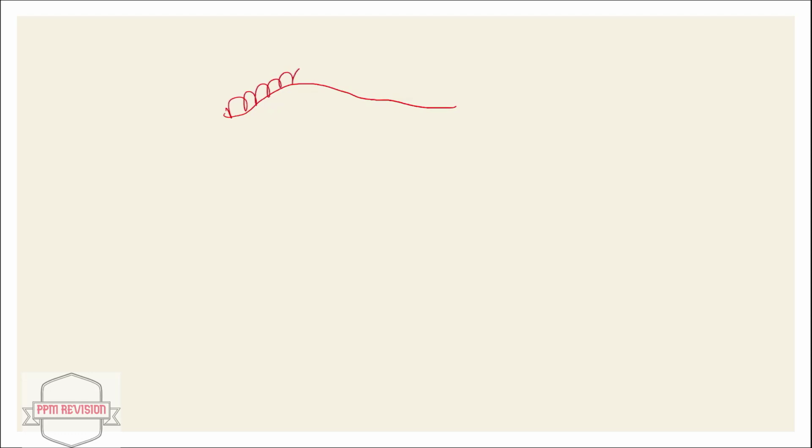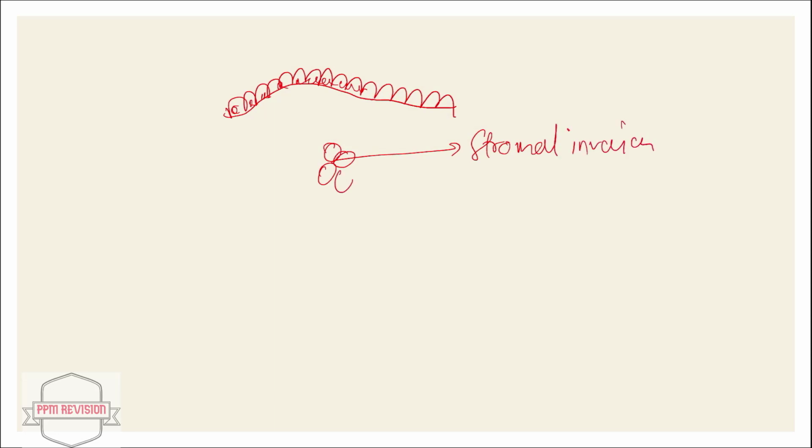So here this is the transitional cell carcinoma. Okay, so here looking at the transitional cell carcinoma, presence of stromal invasion, yes, and there's also presence of anaplastic tumor cells.